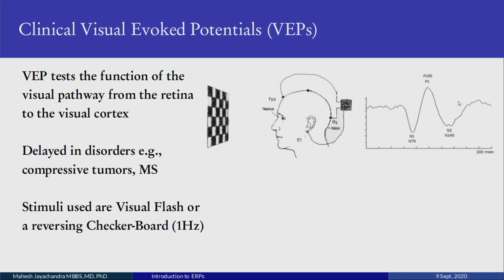The other diagnostic criteria is you actually show the antibodies. But it's pretty obvious, and it's very common that you have delayed visual components in multiple sclerosis. And this is because multiple sclerosis can affect the brain randomly. However, 40% of the brain arguably deals with the visual system. So one of the first signs of multiple sclerosis is prolonged latencies in the visual evoked potential.